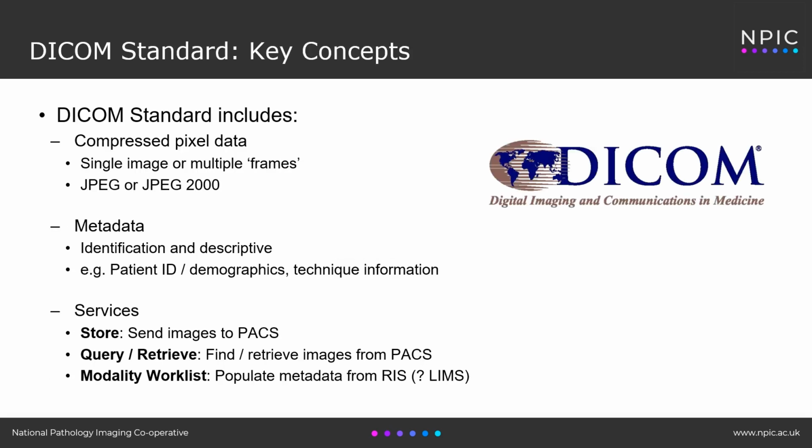Here are a few key concepts of the DICOM standard. The standard itself incorporates, firstly, compressed pixel data, so the image itself as a single image or multiple frames in JPEG format. Secondly, metadata, which is very important in clinical and AI applications, which includes both patient identification and demographics, but also details about the acquisition of the image itself, particularly important in digital pathology, which we'll come back to later.